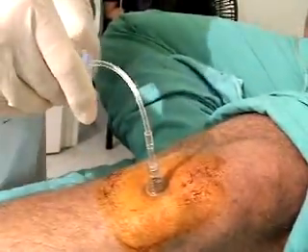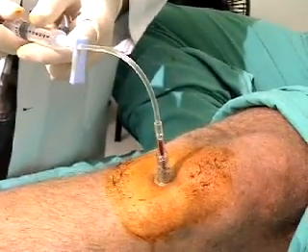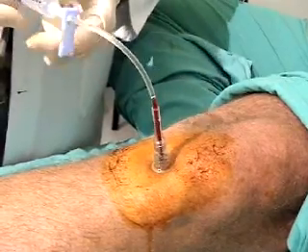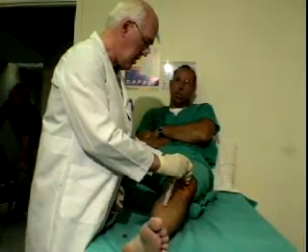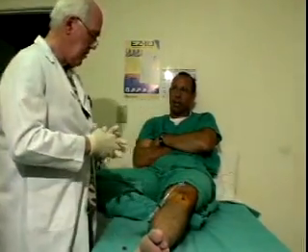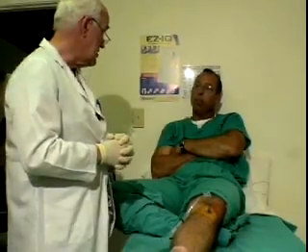Now we're going to aspirate. I can't feel you aspirating. Isn't that beautiful? It's coming out so easy. I can tell you that the insertion was like next to nothing. Absolutely next to nothing. Wow. It was fast, doing it really fast. It was strikingly easy.